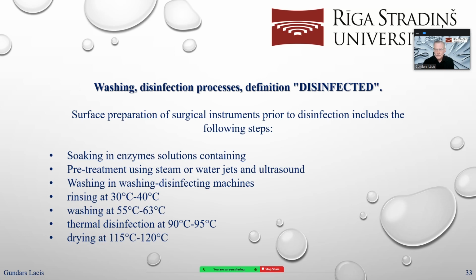Soaking in an enzyme solution, and pre-treatment using steam or water jets or ultrasound, is really necessary. Enzymes break proteins, and then it's really easy to remove them with steam jets or water jets. And after this pre-treatment, washing in washing disinfecting machines.